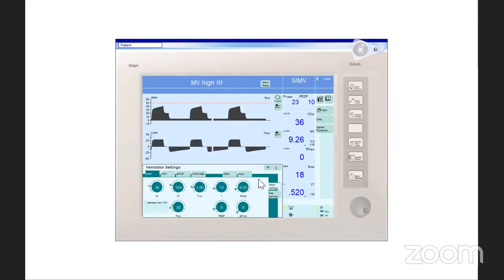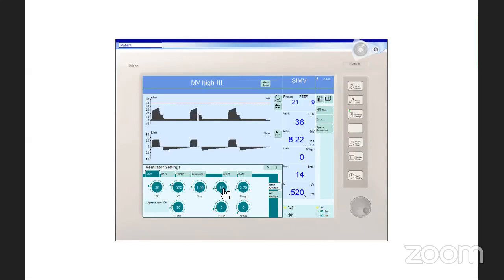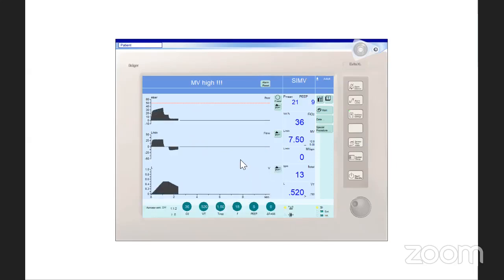And if I go down on the rate to 12, look at how much I lose out of the minute ventilation. So 9 liters is going down. Now we lost 500 multiplied by 6. That's 3 liters, going down to 7 liters. So what you expect, the pH is going to be more acidotic. Yes, that improved the dynamic hyperinflation syndrome, but the patient is... But I will accept permissive hypercapnia, so that's going to work.